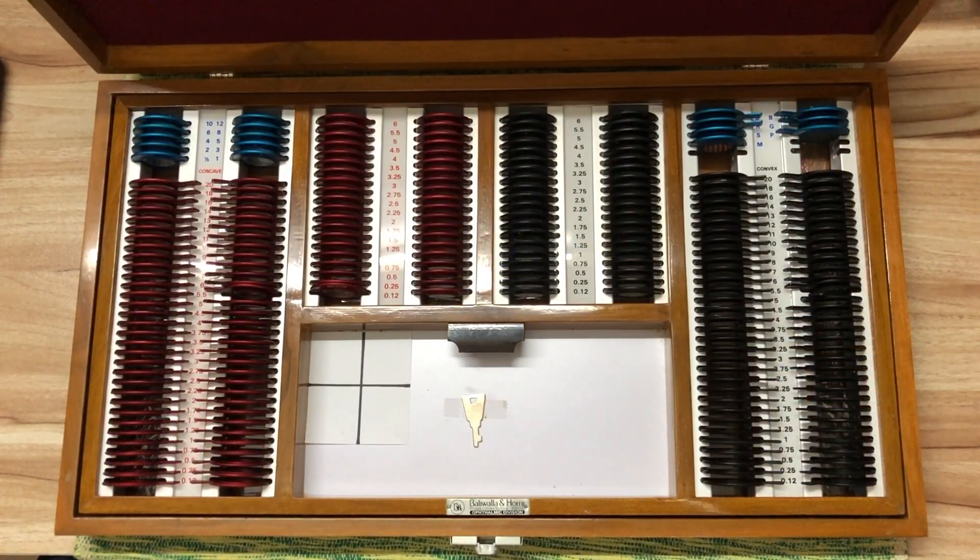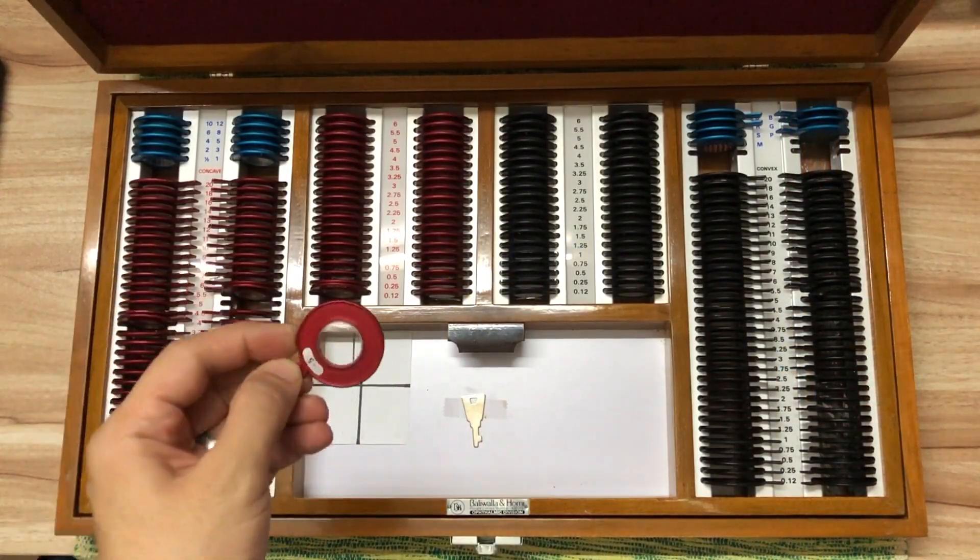Have you come across a situation where a patient or any other person tells you that they do not know their spectacle power? Or are you someone trying to figure out what power spectacle lens you are wearing? In today's video we explore some signs that will help you identify the power of a spectacle lens. Generally, the power of a spectacle lens is identified using an instrument called the lensometer. In instances where we do not have access to this instrument, there are some crude ways in which we can estimate the power of the lens we are seeing through.